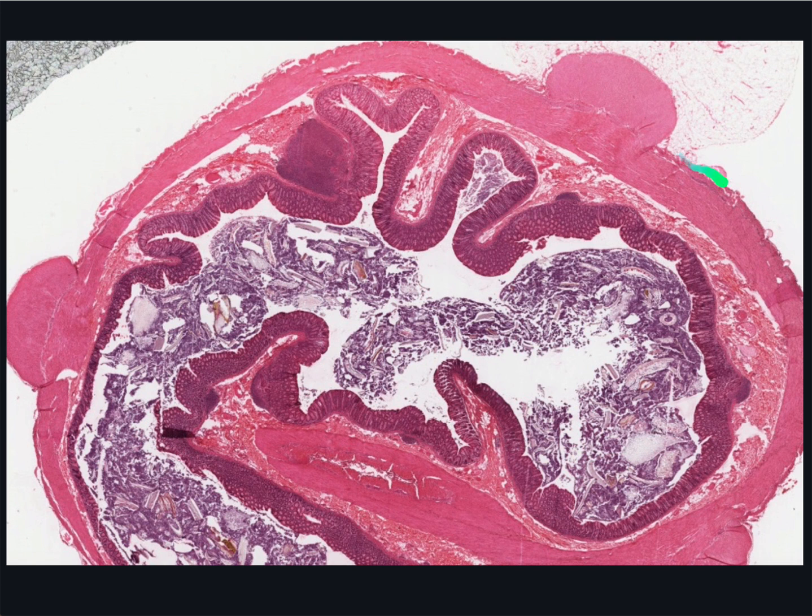A principal specialisation of the colon relates to its external longitudinal smooth muscle layer. This is reduced to a thin layer everywhere except for these three heavy bands known as the taenia coli. These are easily found, even without magnification, as bulges in this cross-section of the monkey colon. Between them and the inner circular layer of muscle will be the ganglia of the myenteric plexus.